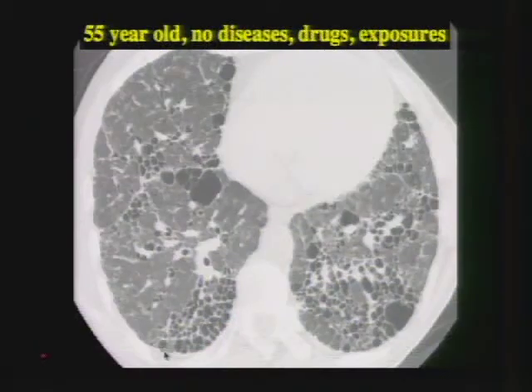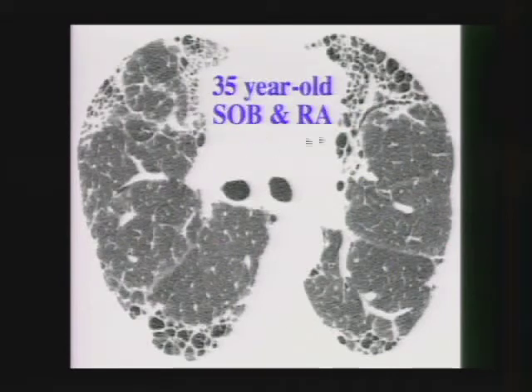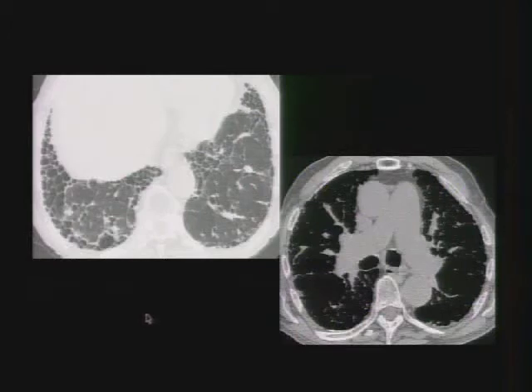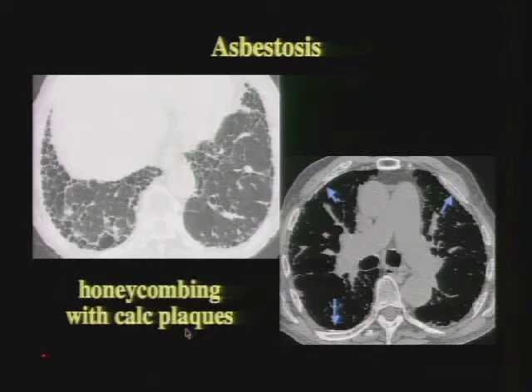A 55-year-old patient with no diseases, no drugs, no exposures — we see honeycombing in the subpleural lung: UIP-IPF. A 35-year-old with shortness of breath and rheumatoid arthritis: by definition this cannot be IPF, but it shows honeycombing — this is rheumatoid lung disease, looking exactly the same. And here a patient with peripheral and basal honeycombing, but on tissue window we see calcified pleural plaques — this is asbestosis. On lung window it looks exactly like IPF, but the calcified pleural plaques give it away.